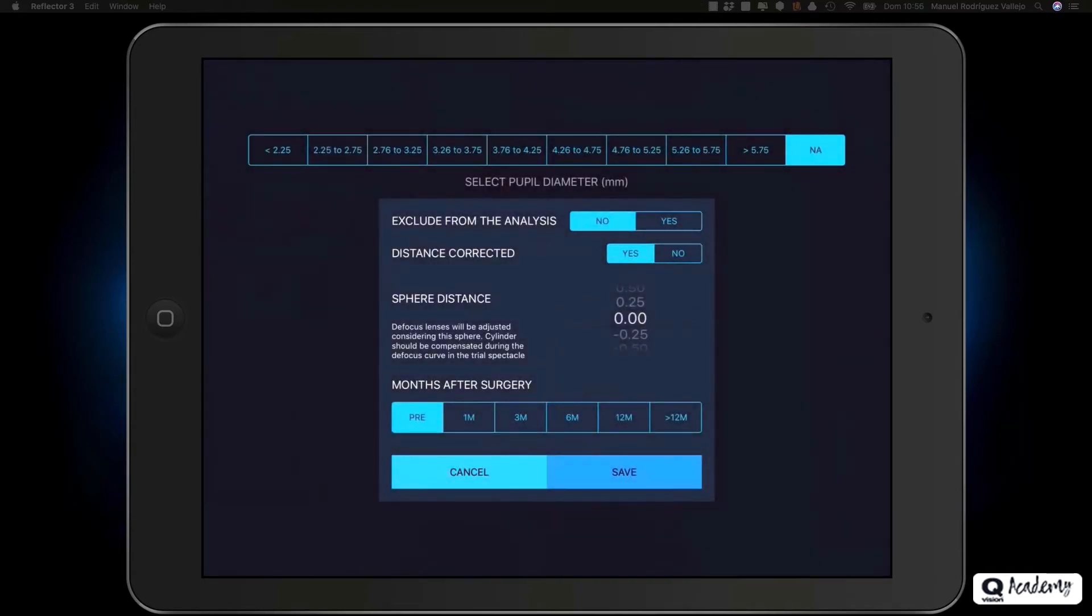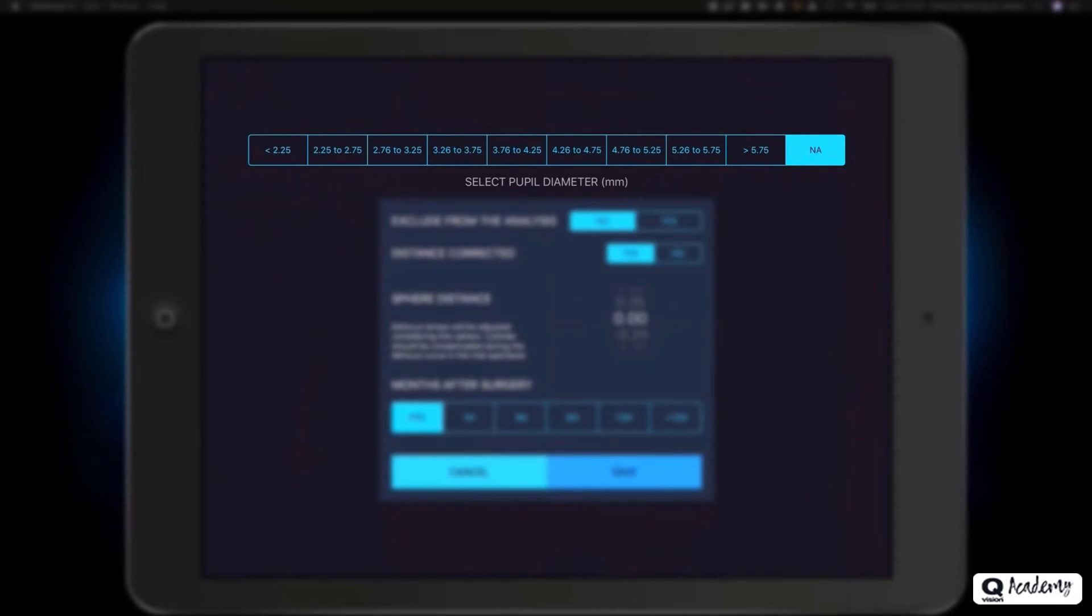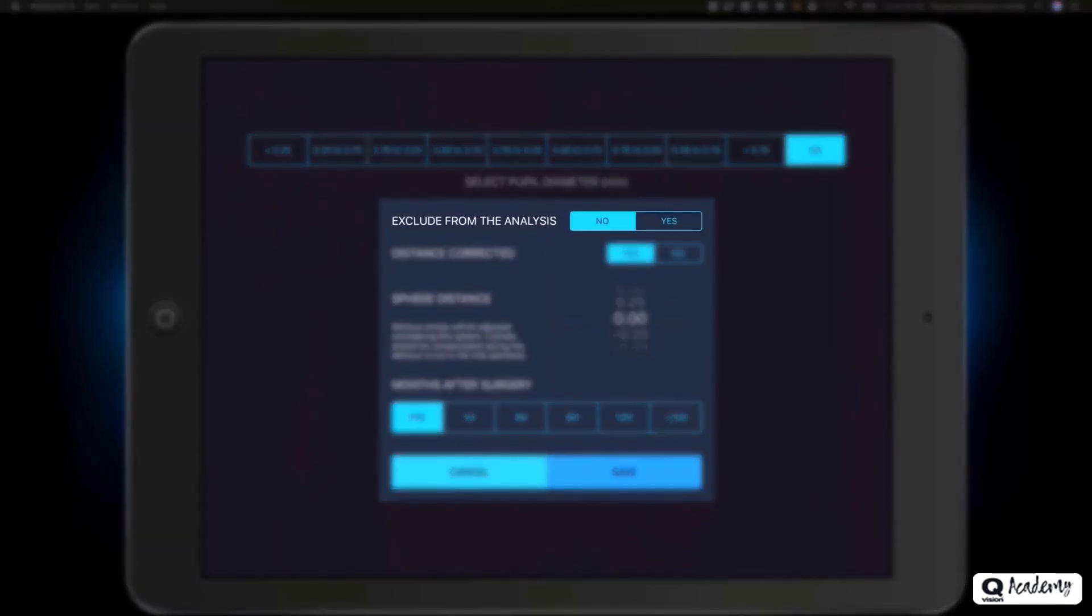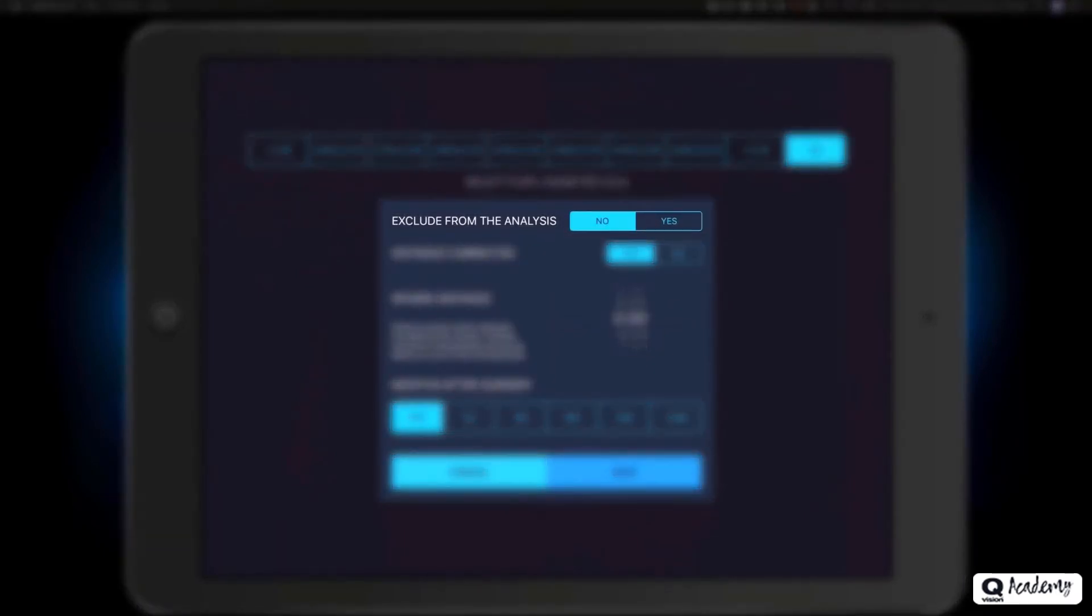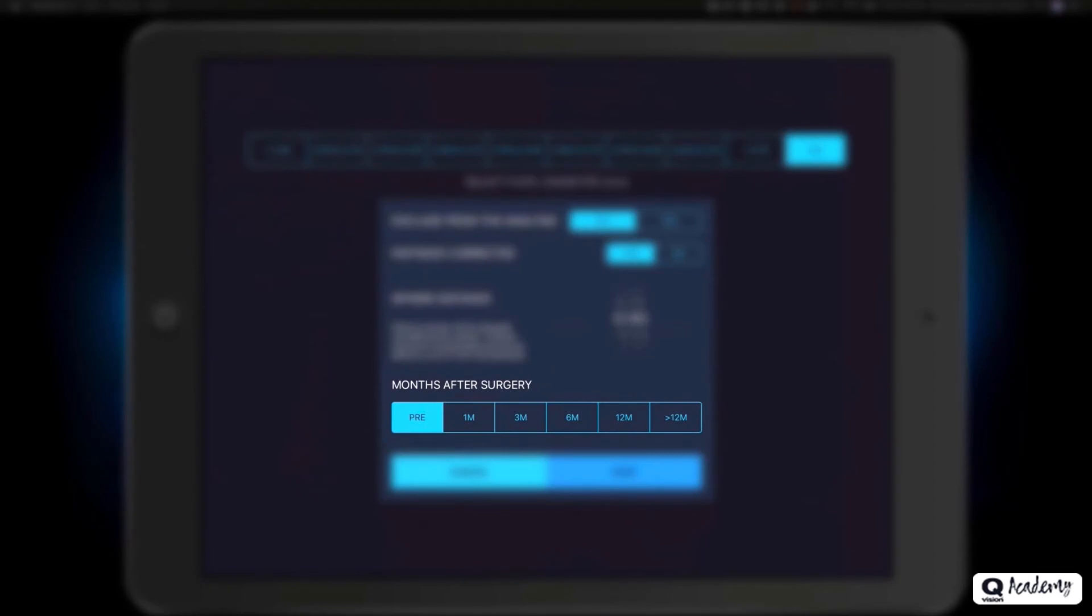Then click the additional button to access the additional information window. In this window, you will be able to select the patient's pupil diameter, exclude the examination from the global analysis, so that it will not be taken into account in the statistics section. For example, in cases of ocular complications, or when exclusion criteria are met.